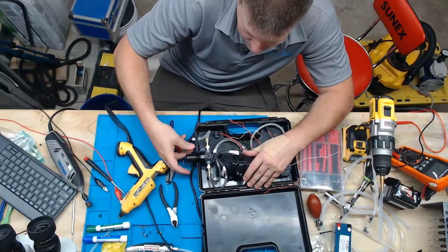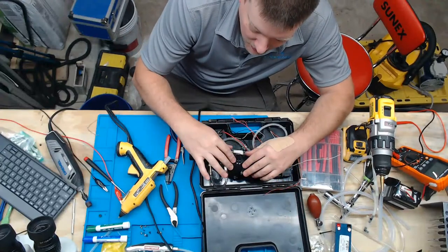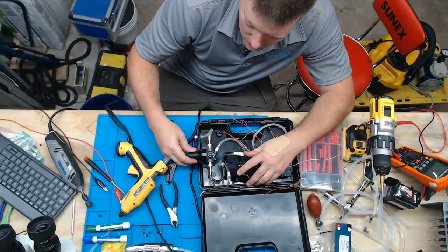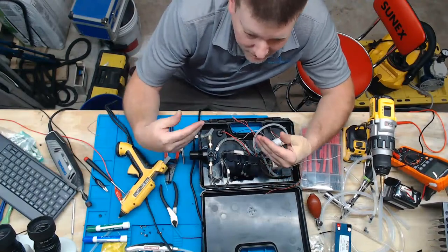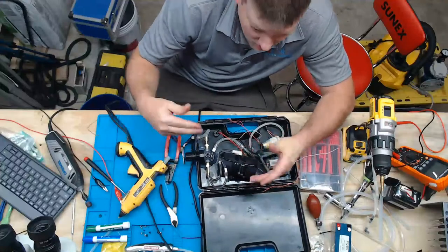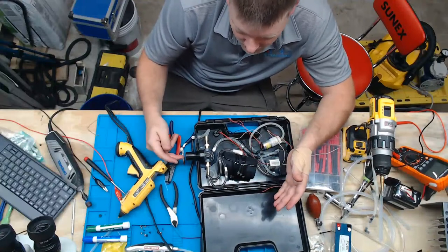Well, you just pop this guy all the way down and then you let the compressor run. It'll fill up this little air bladder right here. And then you can start regulating it to get to your 100 millimeters of mercury. And then if the very next pressure you need to reach is 250 millimeters of mercury, well, that's a little bit of a jump. So you turn this guy right here until it reaches 250 millimeters of mercury.